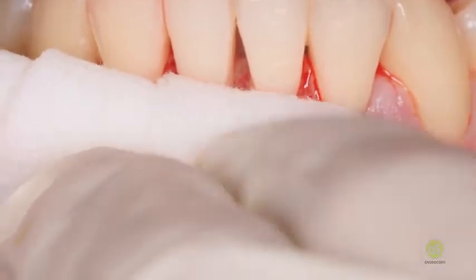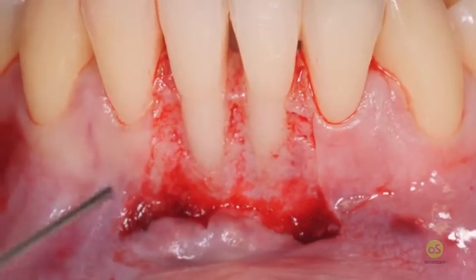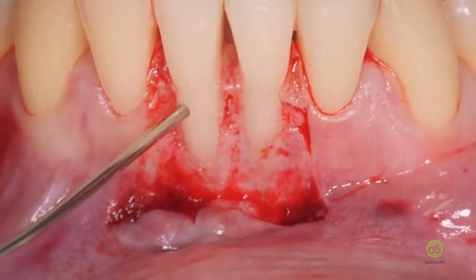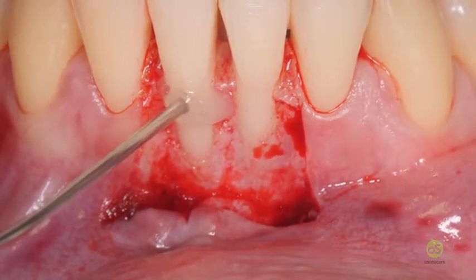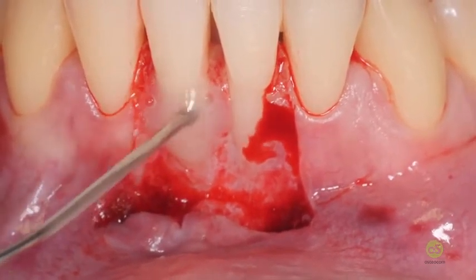Now it's time for the application of amelogenins. During the time it takes for me to take the graft, these amelogenins can work. So I apply the gel now on the root under a very, very good control of the bleeding.